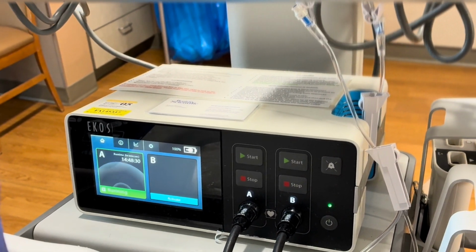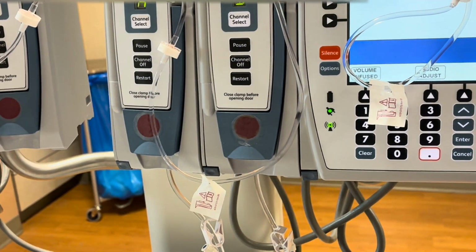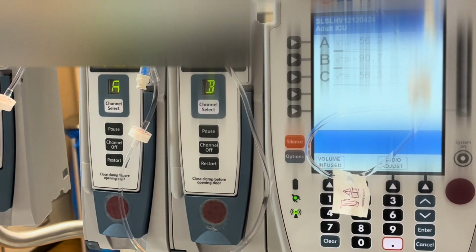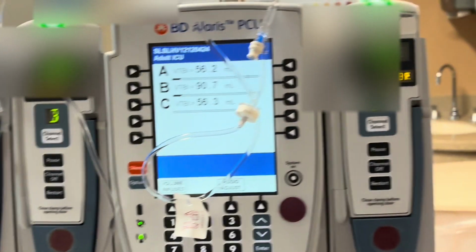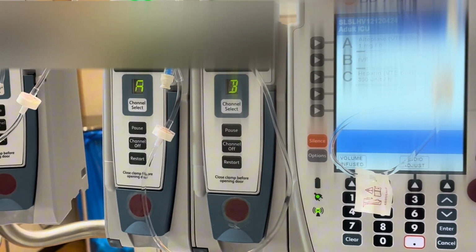You could actually increase your saline. Usually we have it at 30, 35. You could always increase your saline until the flashing disappears, because the flashing means the heat is so high. That's why you have saline running in there. And then you have your heparin. Of course, you want the blood to be thin, and then of course your thrombolytics.